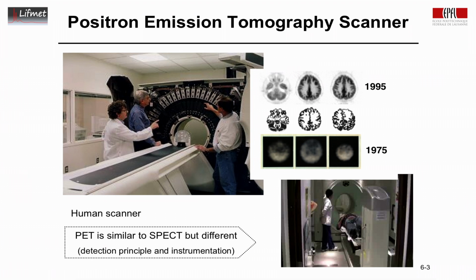The detection, as I mentioned, is very similar to SPECT, but the principle is different, and this has to do with a detection principle, and therefore this has an impact on the instrumentation of the positron emission tomography or PET scanner.